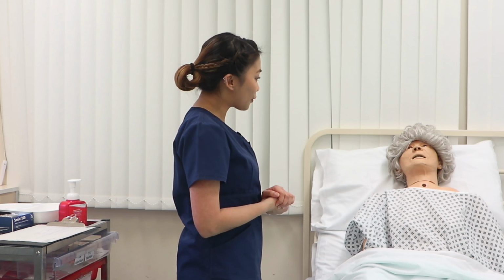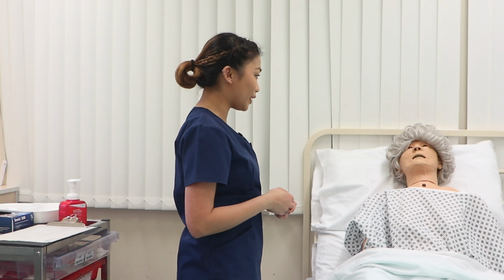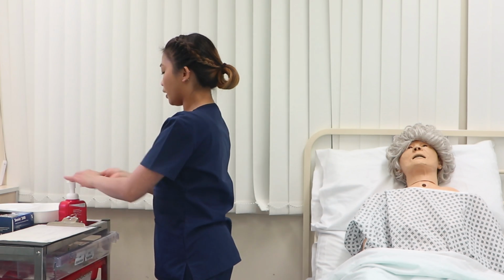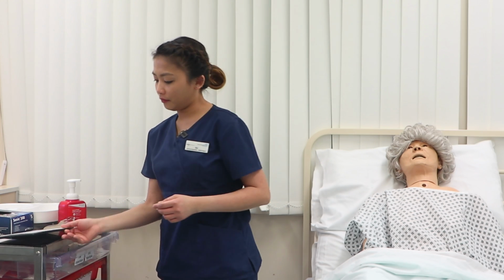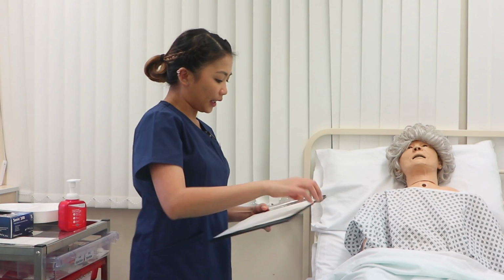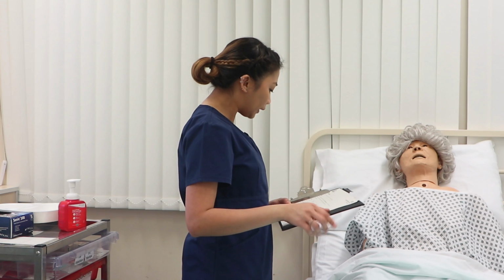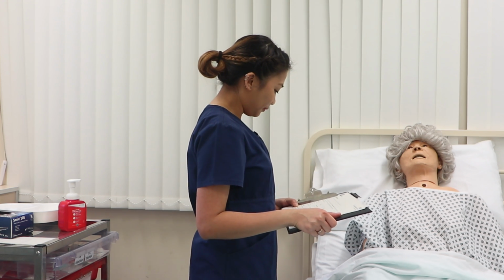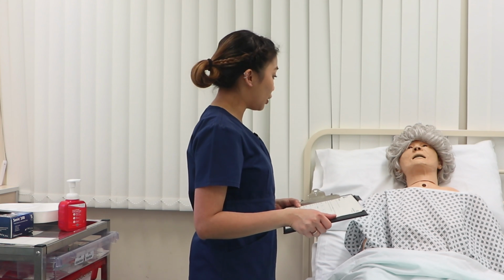Is that alright if I close the doors and windows to provide you some privacy? Closing the doors and windows. Do a quick hand rub. Emma, can I just check your full name, your date of birth, and your address, please? Alright, that's all the same with your notes.